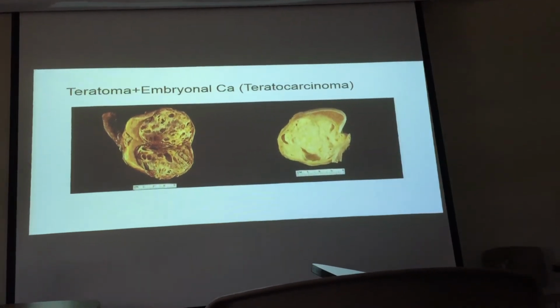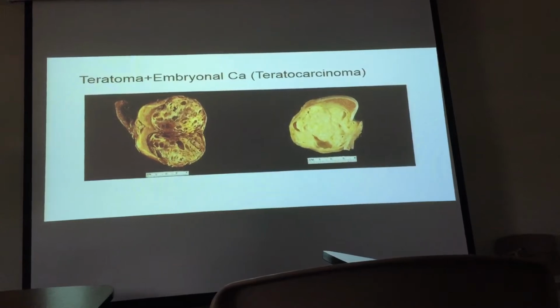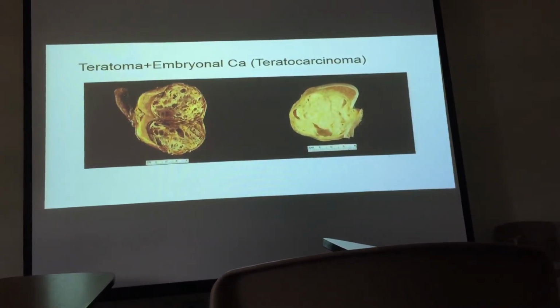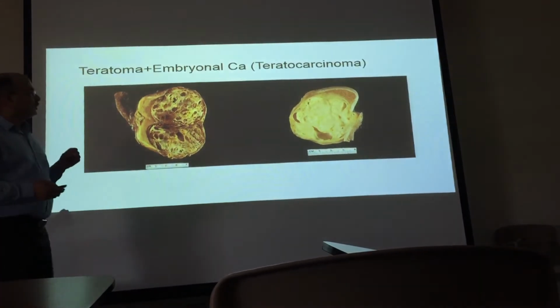There is penetration. Larger. What other feature? Penetrate the capsule. Penetrate the tumor, penetrate the capsule. Okay, here you can see damage to the capsule. Okay. What else?